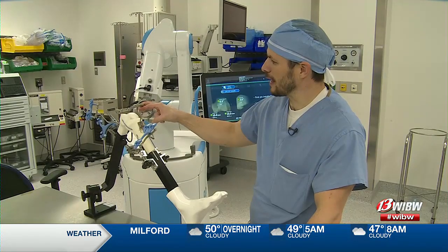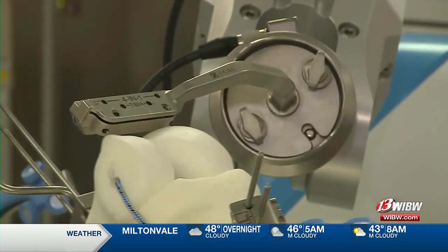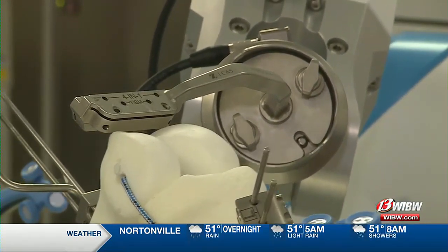The robot will bring that in and align it with the femur to make the exact cut we mapped out. And if I move it, you can see how the robot moves with the patient to maintain the same alignment.